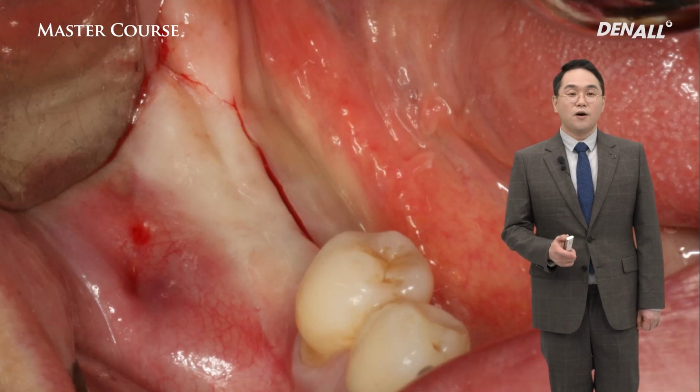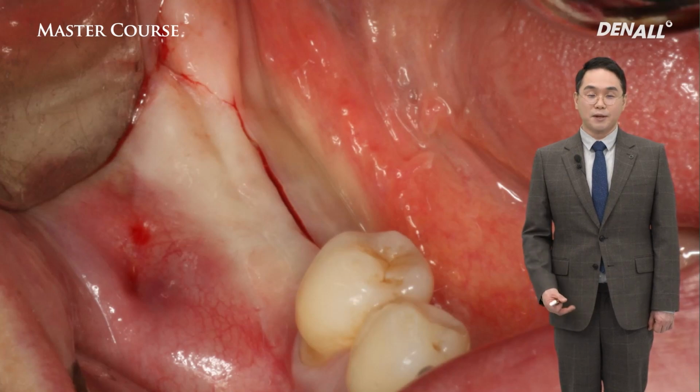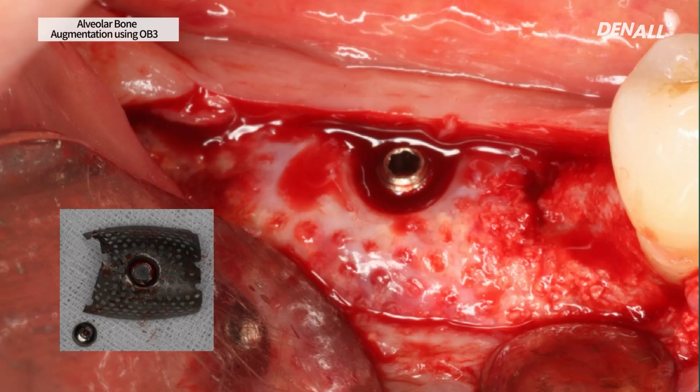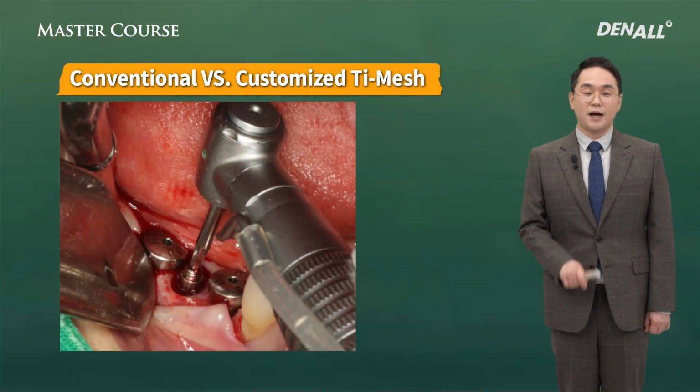To remove the Jawbuilder, only a horizontal, crestal incision is made, not a vertical incision. As I said before, to fix the Jawbuilder, only a cover cap is used. The flap is raised, the cover cap that fixed the Jawbuilder is removed, and the Jawbuilder is removed. As you can see, the ideal bone is regenerated buccally and lingually just in the form of the Jawbuilder. And vertically, bone is regenerated. The driver used to fix the tenting screw is reversely rotated to remove the screw.